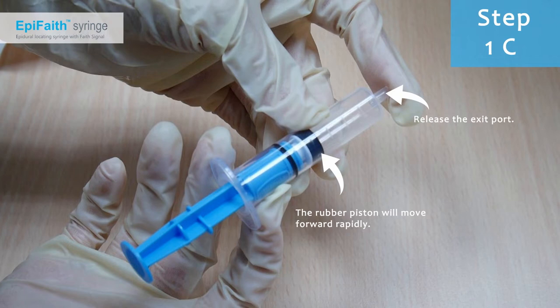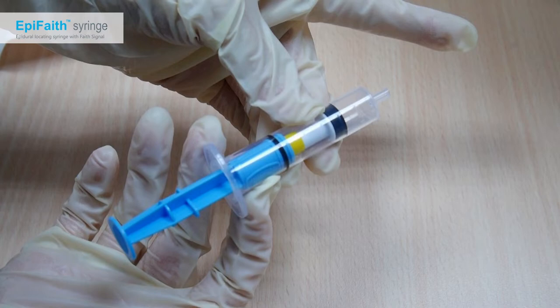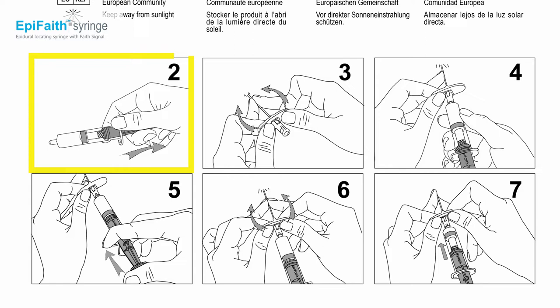Now release the exit port. The rubber piston should move forward quickly. Do not use the syringe if it fails any step. After the function test is completed, fill the syringe by withdrawing the plunger. Epiphaeth is compatible with both air and saline — please match your preferred sensing medium with the patient's characteristics.